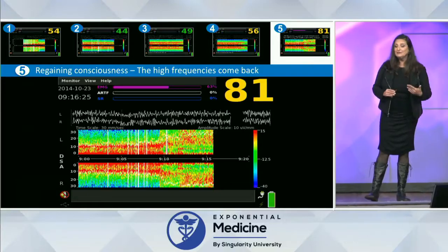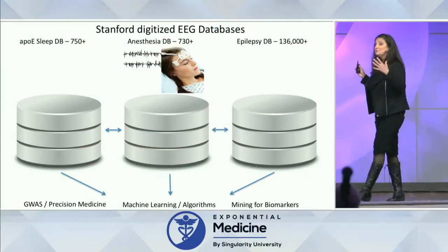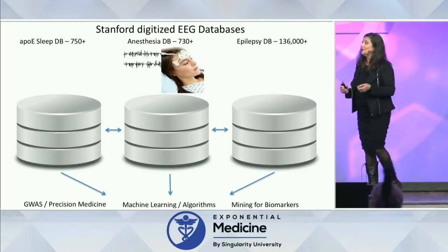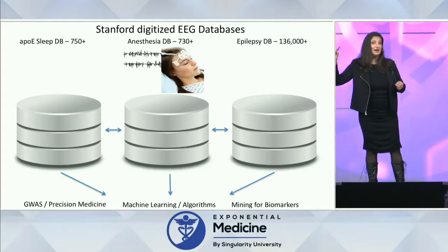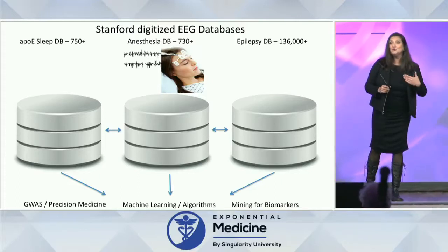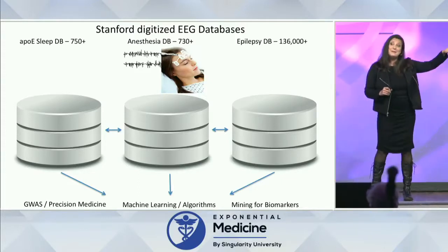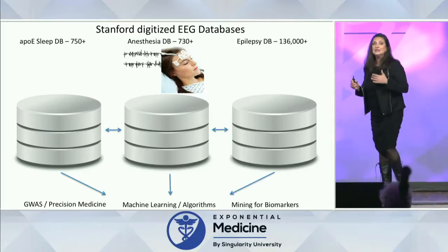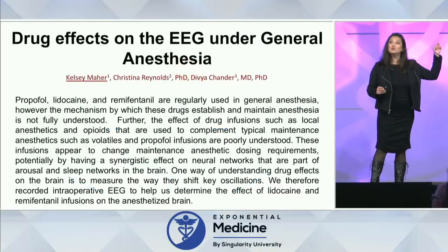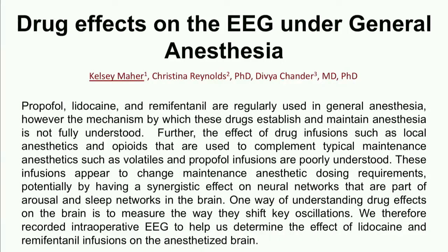And over at Stanford, one of the things that we're doing is we're combining databases that I've recorded in the operating room using an electroencephalogram with people in our sleep labs and people who study epilepsy. And then we're using these databases to write new brain monitoring algorithms. We're using them to mine for biomarkers. And we're actually looking at the genetic basis for all these different neural oscillations. In fact, we're creating a drug dictionary for the effect of every drug that we administer and what it actually looks like in the EEG. So that's my brief tour of reading brains.